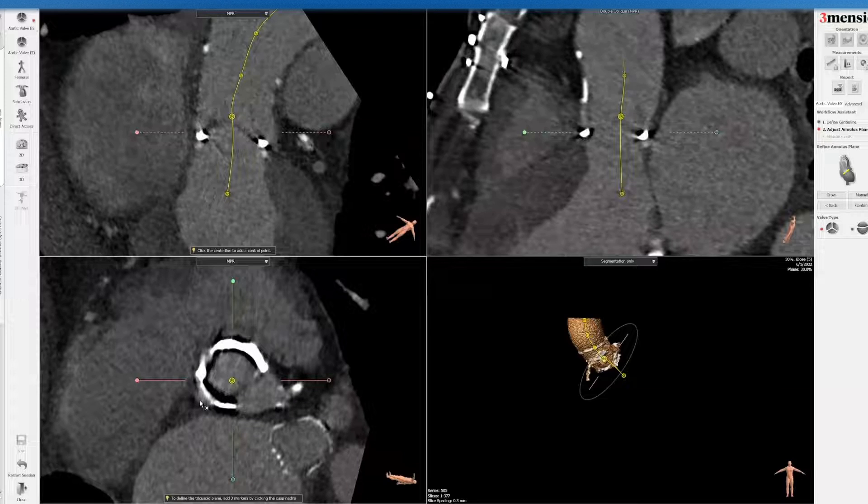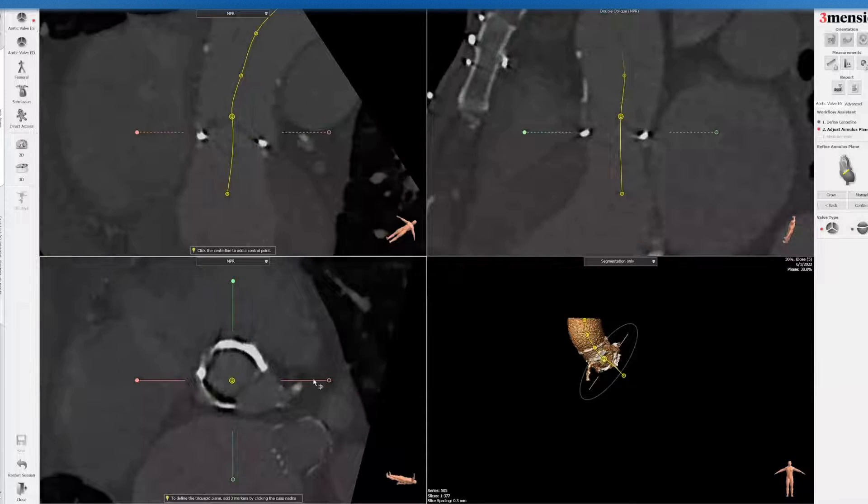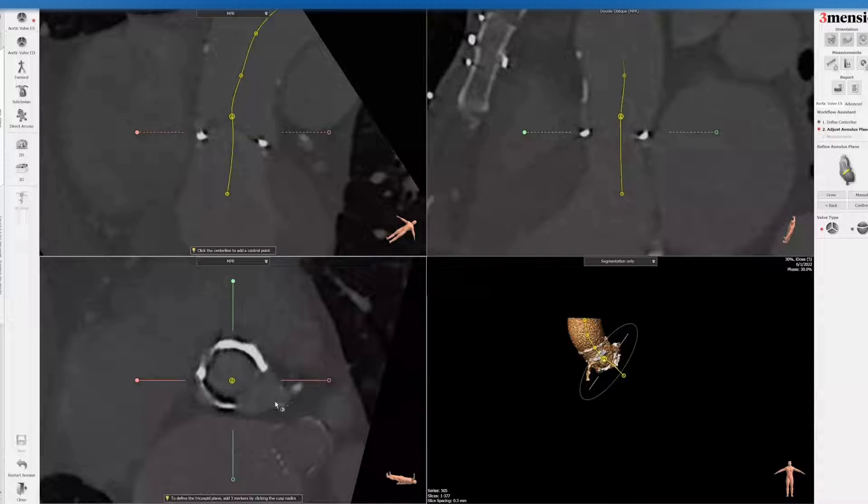This is one of the more challenging valves to evaluate because the commissural posts are not easy to see — in fact, you probably can't see them at all. So you have to rely on the leaflet morphology as you look up the aortic root. Also, the waviness of the inflow makes it difficult to identify the base of the annulus to create the annular plane. There's also a blooming artifact with this particular valve, so I typically drop the gain as much as possible, because the internal diameter is actually quite a bit smaller than the manufacturer label.